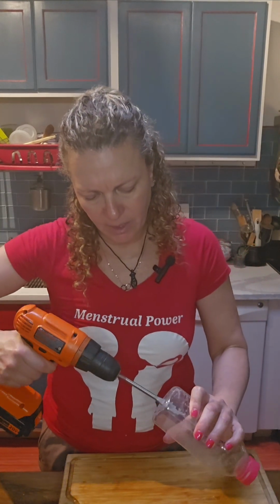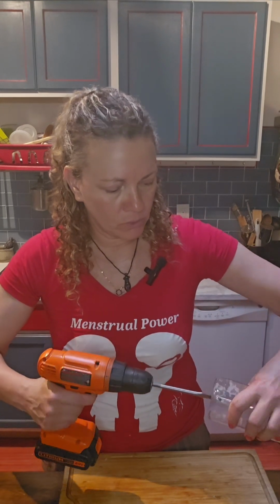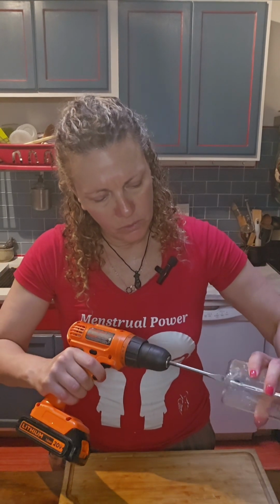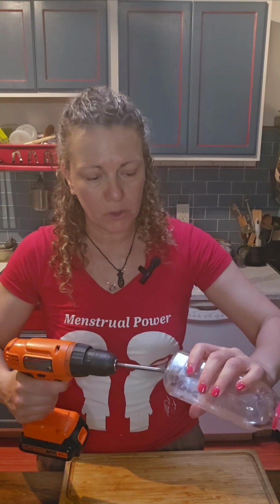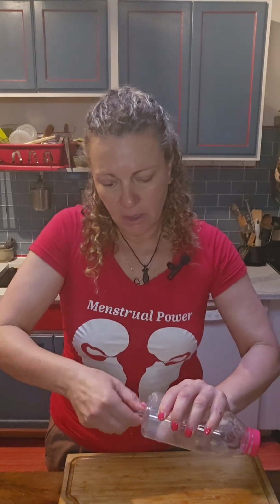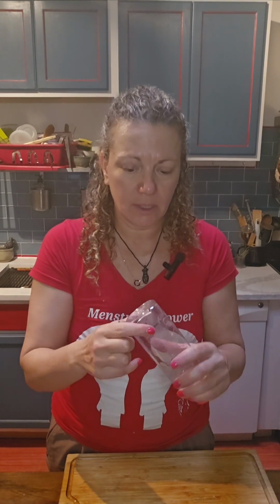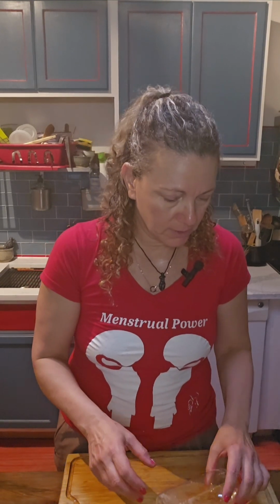Okay, now I don't want to have any edges, so I will continue drilling until all the edges come off, because I don't want the condom that we will be using later to tear. And let's see if the tube is entering. Yes, and it's entering exactly the way I want it. I want it to be tight, so it will hold the condom very tightly. Okay, so now we can move to the next phase.